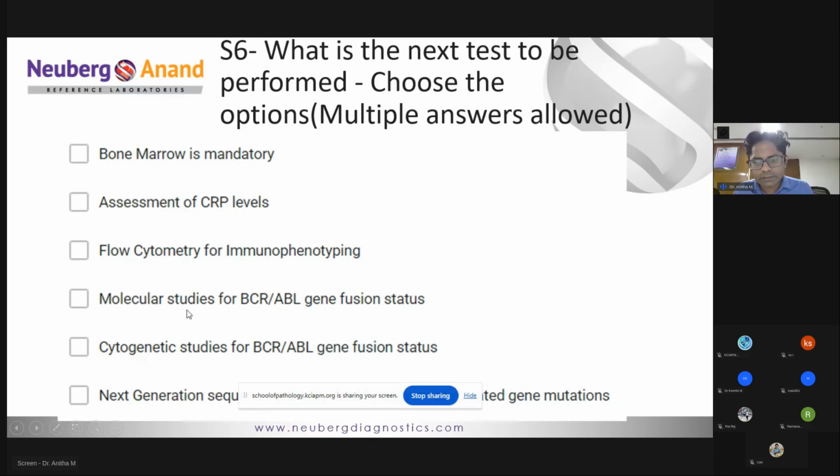A molecular study like PCR would be much better because we have to know what the transcript type is, 210 or 190, because that is your MRD. Whenever you think of a patient with CML, your MRD is your PCR based analysis. So at diagnosis, you know what transcript it is, and based on that, we start monitoring the patients, and that's how you would know the treatment response.